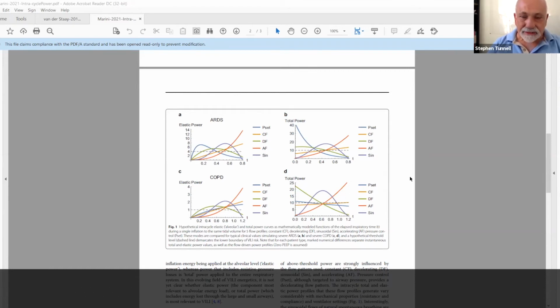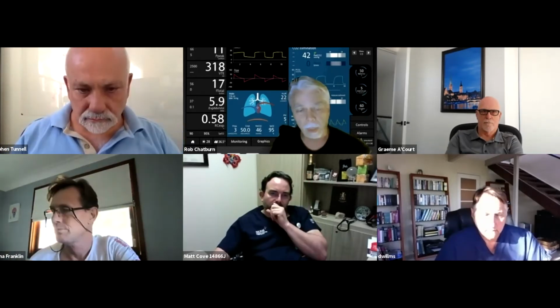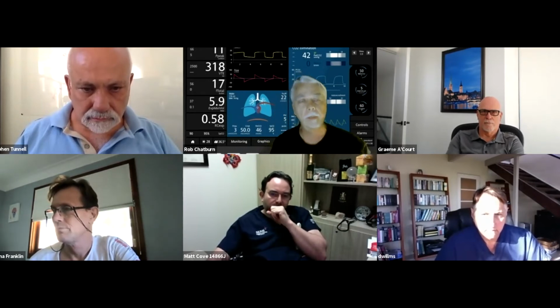But it's related to the same concept that damage is done near the terminal end of that breath versus the early phase. Well, that's what these guys are trying to say. It just depends on what flow waveform you're using, right? Yeah. He has invented this term called intra-cycle power, that you can plot power not as a digital number per breath or over a period of minutes, but power per second during inflation. It's just an example of how you put a concept under the microscope, and the more you see, right?